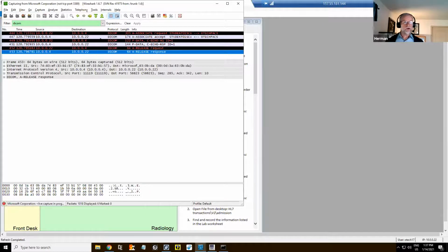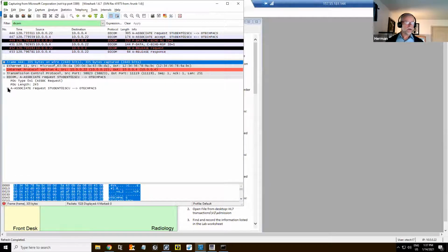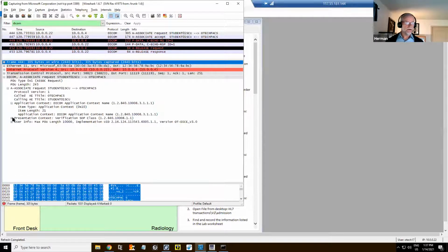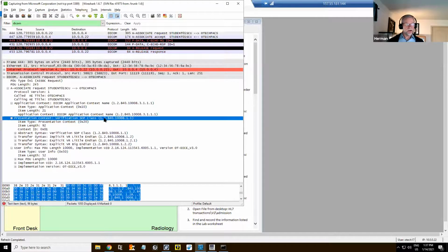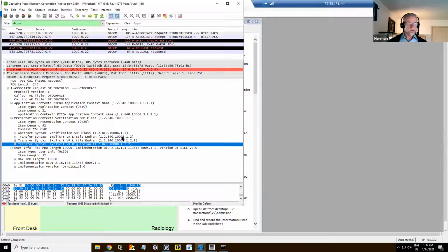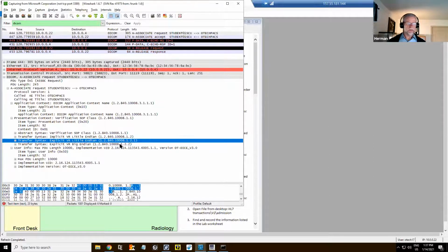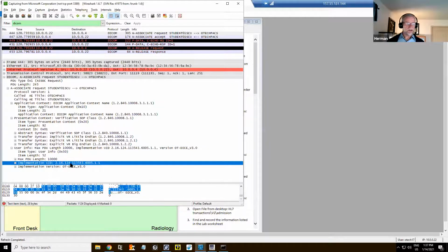So let's look at my associate request. I click on the top, and I'm going to click on all these pluses. I see now that part of the negotiation was a verification SOP class proposed with 3 different transfer syntaxes: implicit VR little endian, explicit VR little endian, and big endian, which was the way it was being configured. And the PDU size proposed was 10,000, and the implementation class UID 2.16.124 really identifies the sender and then the version number.